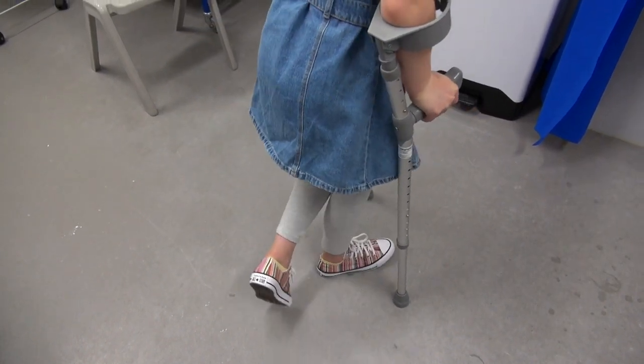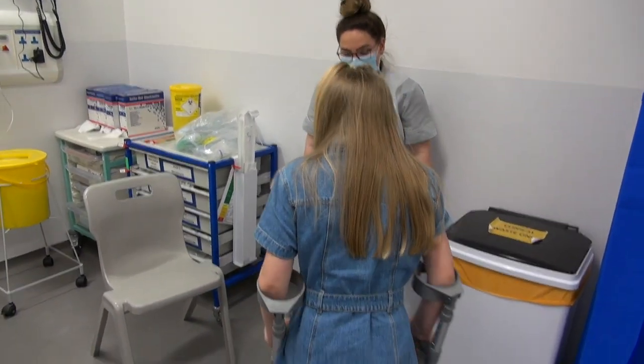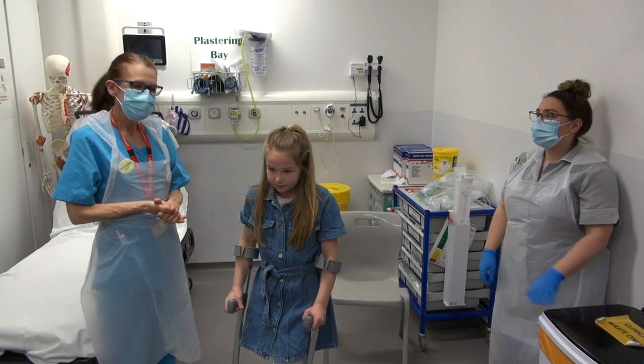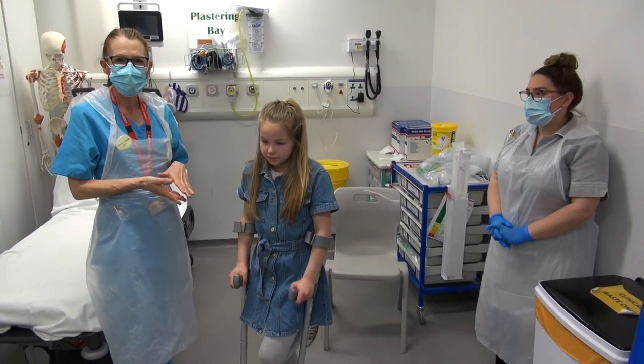Just keep looking up and see where you're going, just so you roughly know where you're going. Just take your time as well. Slowly. That was a demonstration on how to measure some elbow crutches. That was non-weight-bearing.